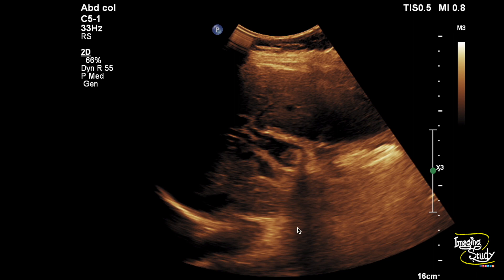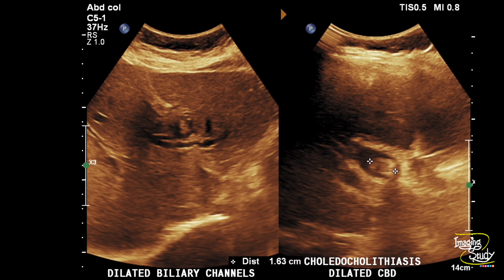Here's another picture of the common bile duct calculus causing proximal dilatation. The common bile duct calculus measures around 16 mm in diameter and these are the dilated intrahepatic biliary channels.